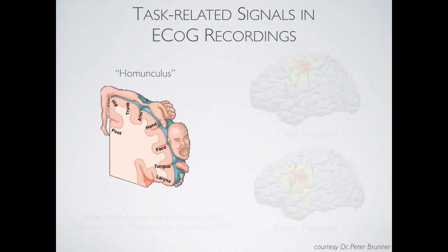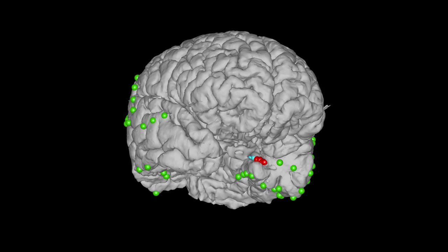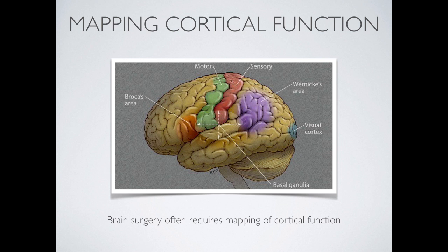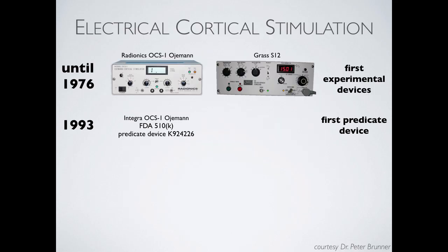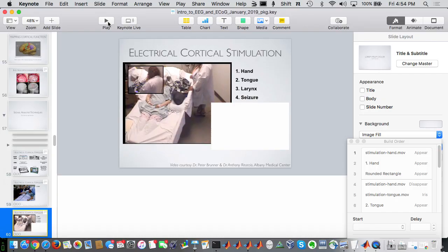That would be, for example, there it was. Yeah. So that whole mapping procedure in motor mapping, you might find tongue down here and hand motor up here, but language we would find here and here. Of course, the conjunction of the 3 are all necessary for language. And now you'll see the 3.